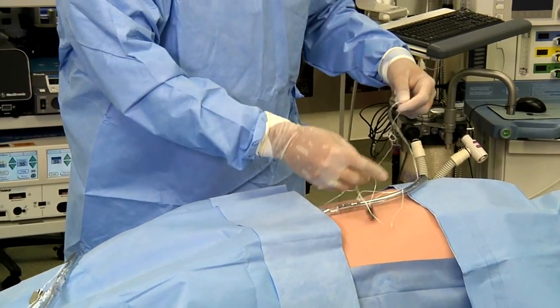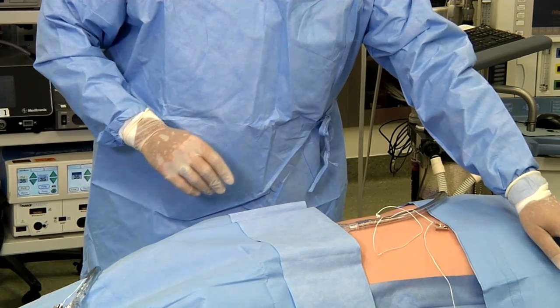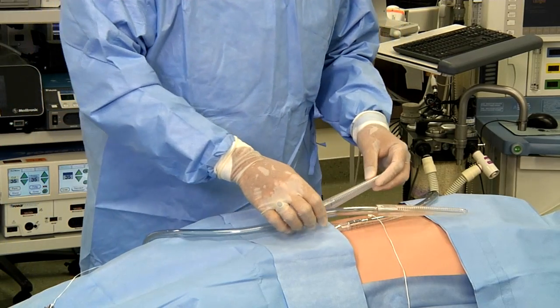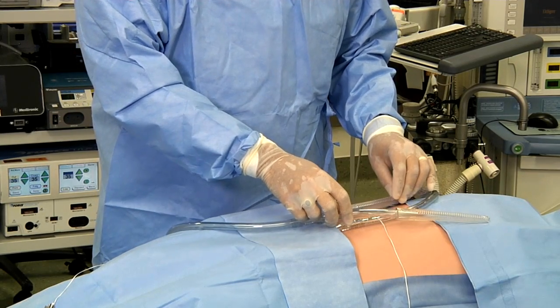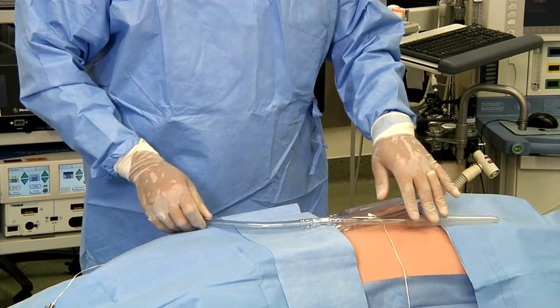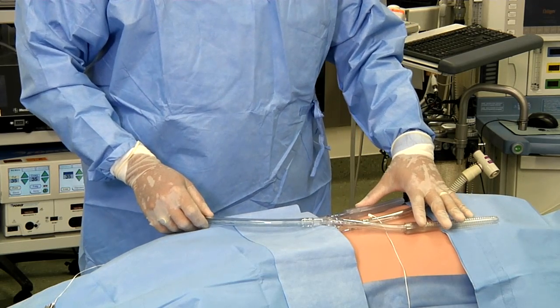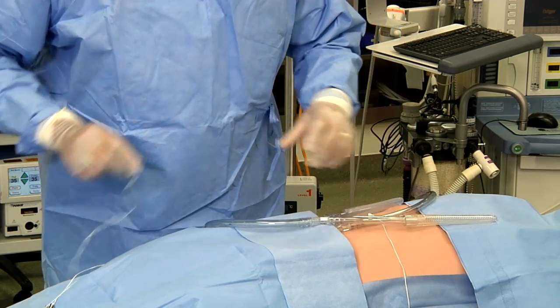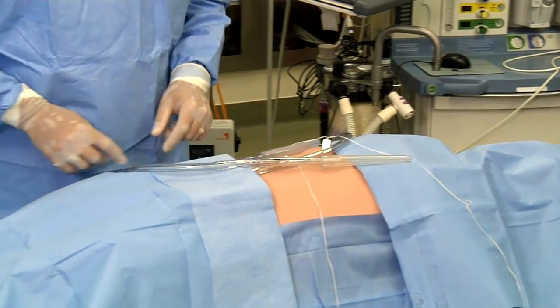The outflow tubing is placed superficially into the patient, up towards the diaphragm and on top of the liver bed. Be careful not to place the tubing so that it would become completely encased by bowel or omentum, as this would restrict the flow. With that in place, the outflow temperature line can be handed off the sterile field.